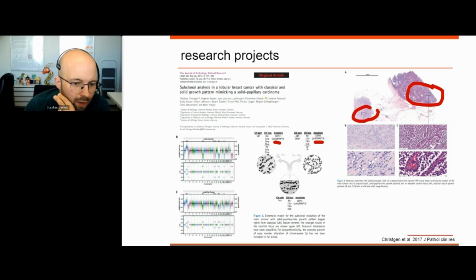analyzed by the OncoScan. They share most of them, and some are individual. So we conclude that these 2 tumor regions must have the same ancestor lesion and underwent tumor evolution in follow-up.